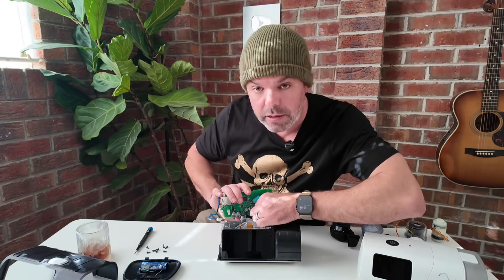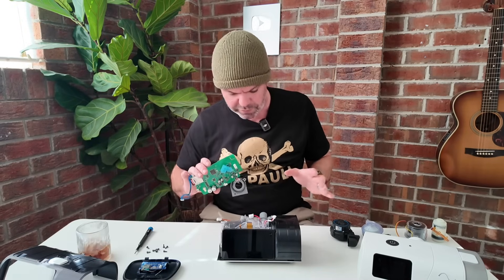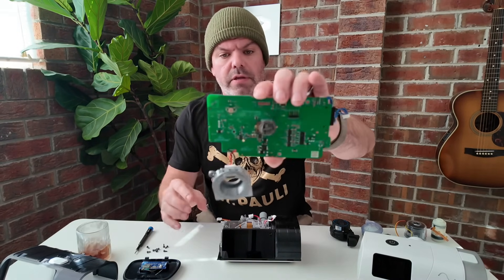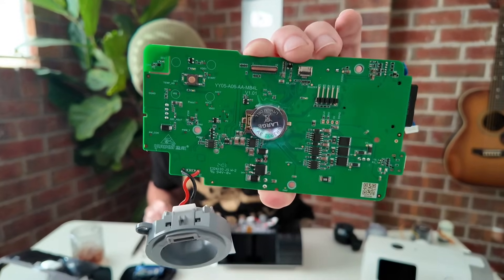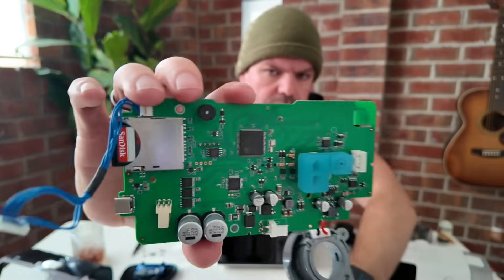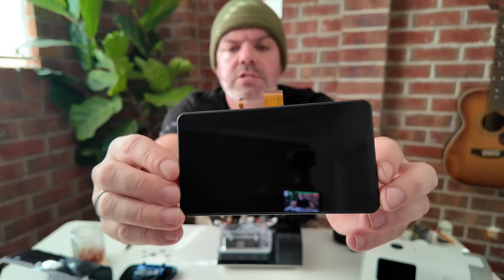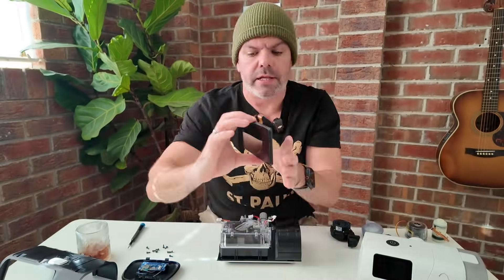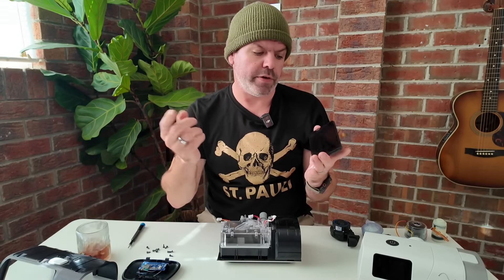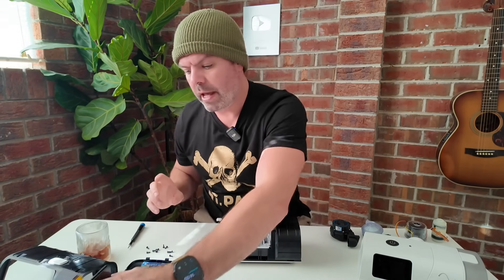So it's completely different to the AirSense 11 internally — this is a completely different device. Now this screen is awesome. It's super responsive; it feels almost like you're using an iPhone. The colors and brightness are really, really cool, and I think other companies will likely follow suit.